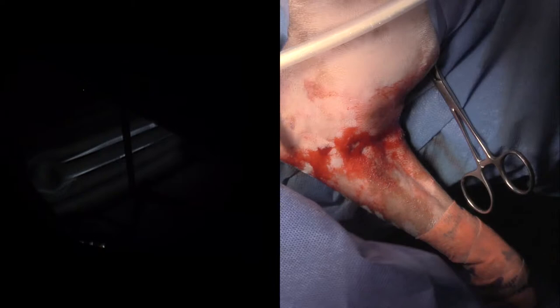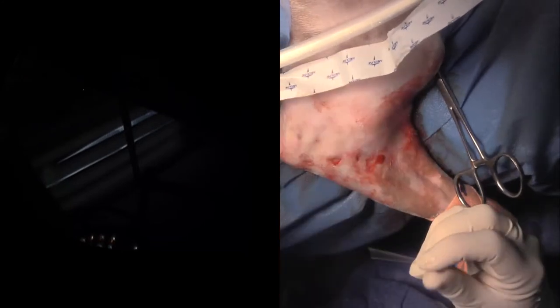We have scopes going all the way down to 1.9 millimeter rigid scopes, and we have some flexi scopes that are down to about a millimeter, I think it is, for the needle scopes, all the way up to 4 millimeter for really big dogs. So that's the limiting factor.